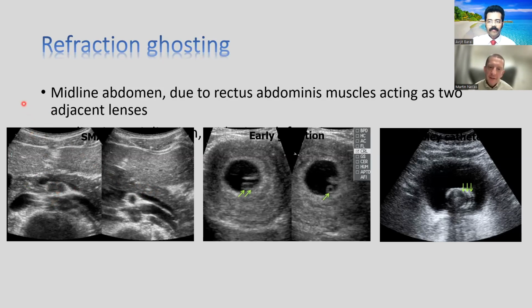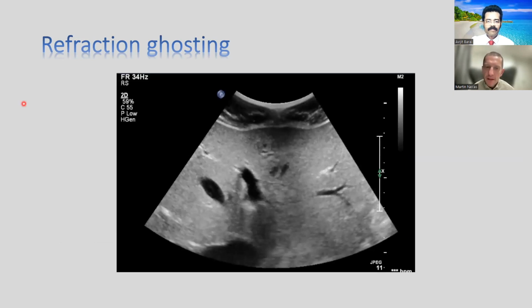Absolutely. And in fact, recording video clips is so much better than static images because, you know, at 20 frames per second, which is quite modest, and we sometimes work with much higher frame rates, within, say, 3 seconds, you have 60 frames of information instead of just one. So I think we certainly encourage our staff as well, particularly when there's something ambiguous or something a little bit tricky, to take a video clip because it's much better to review.